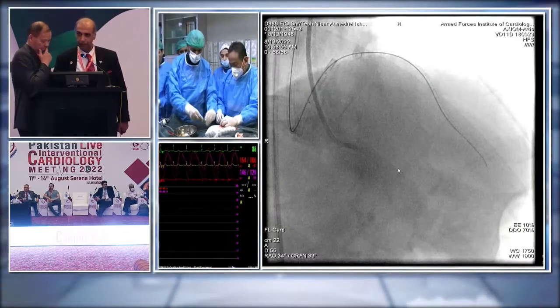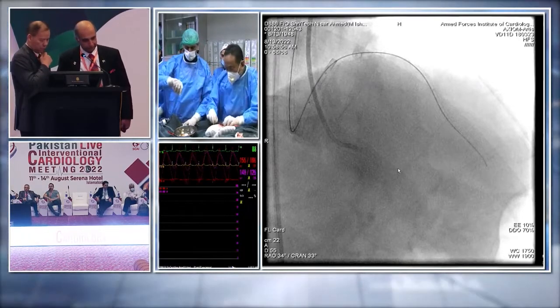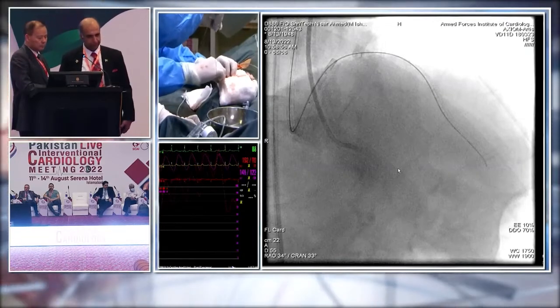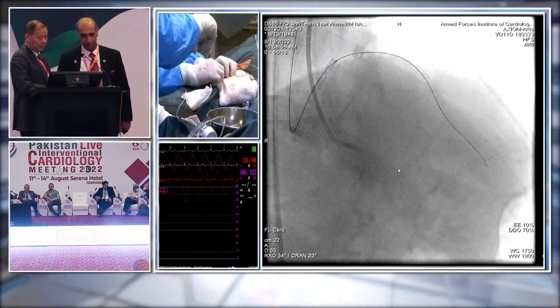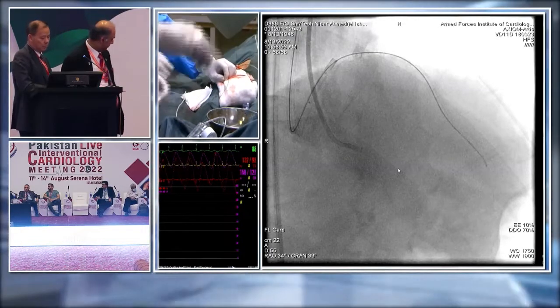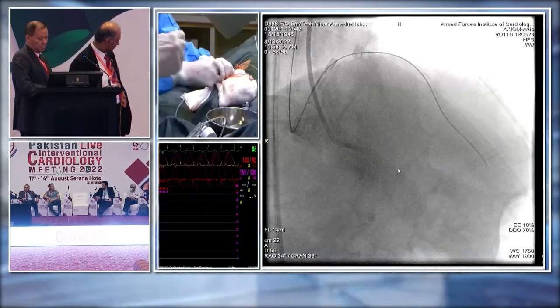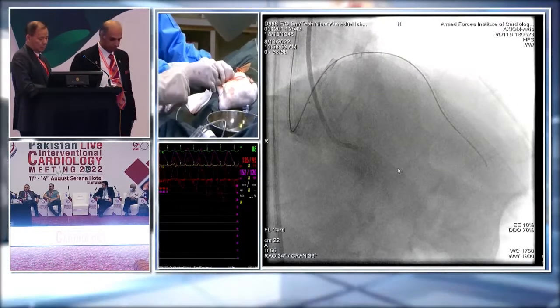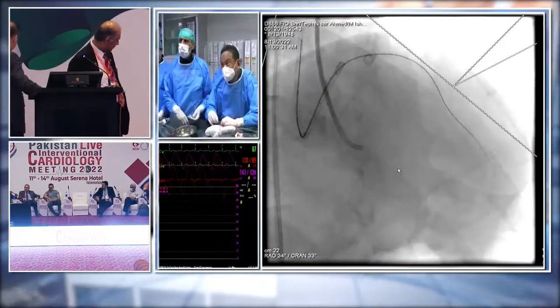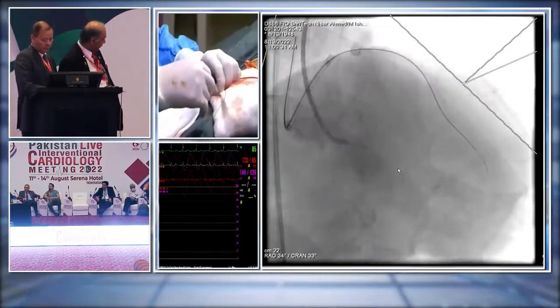And if you don't have a trapping balloon, do you use a regular balloon to do the trapping? Yeah. We're using a regular balloon. It's a 2.5 balloon for trapping. It's semi-compliant, 2.5, 15. It's a normal thing. Sometimes you use 2.5 for 6 French and 3.0 for 7 French. I don't do inflation pullback because in CTOs you can lose your wire position. But you also have the Trapliner available elsewhere that you can use because that helps in exchange. But for us, it's all about economics at the end of the day.